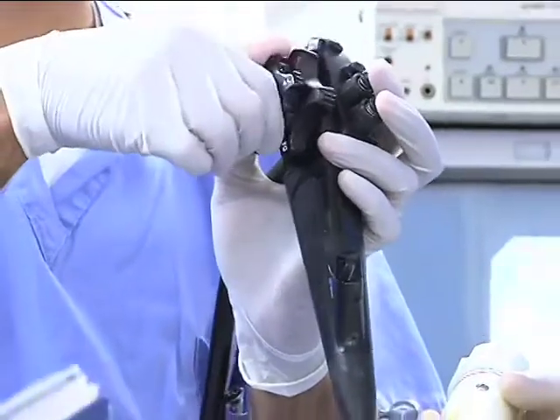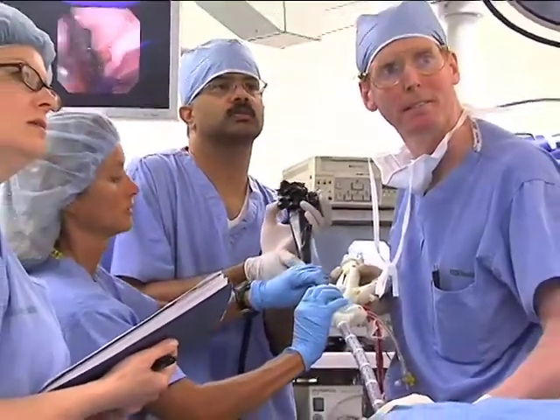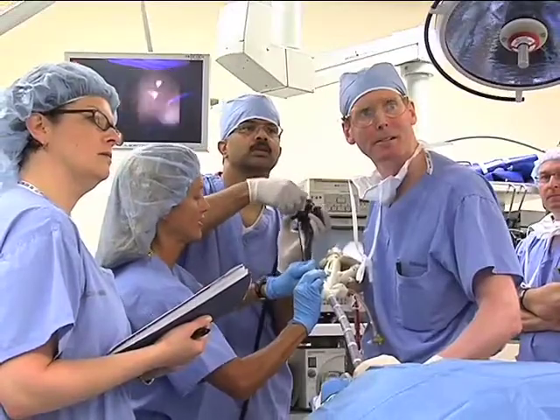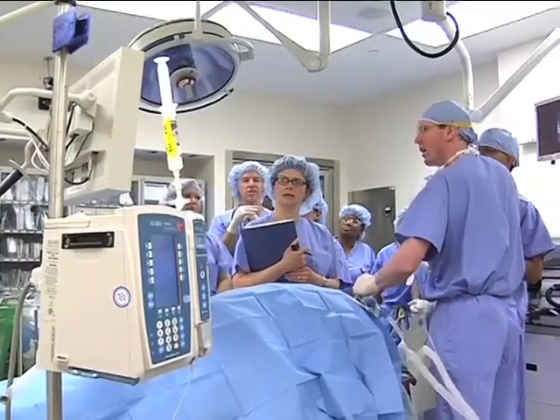We've known for many years that gastroplasty, particularly an operation called a vertical banded gastroplasty, has been effective at helping people to lose about 45% of their excess body weight. What's exciting about this new device and procedure is that it simulates that operation but completely through the mouth, with no surgical incisions on the abdominal wall.